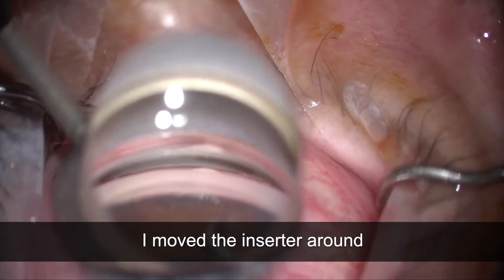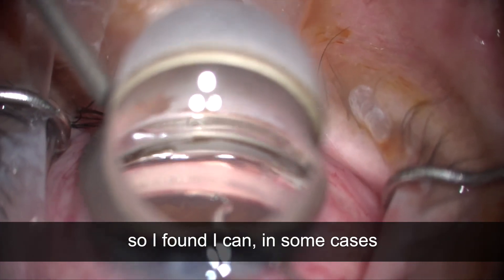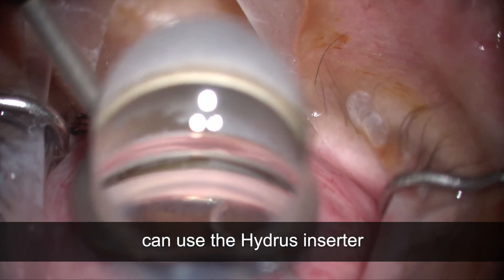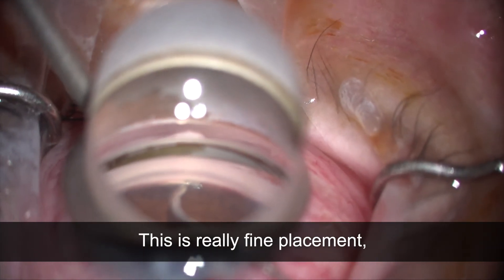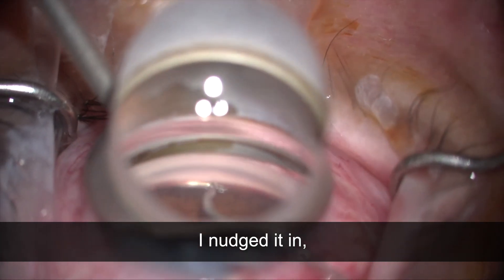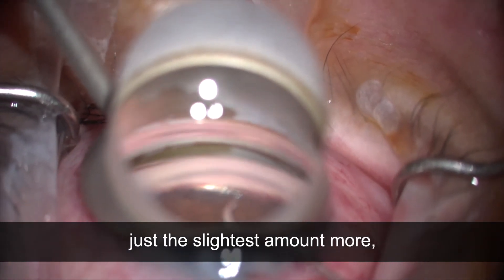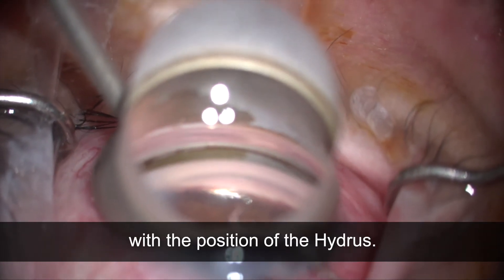I moved the inserter around and found that in some cases I can use the Hydrus inserter to push the implant in just a little bit more. This is really fine placement, but as you can see I nudged it in just the slightest amount more to get things tucked away to a position where I'm really happy with the placement.